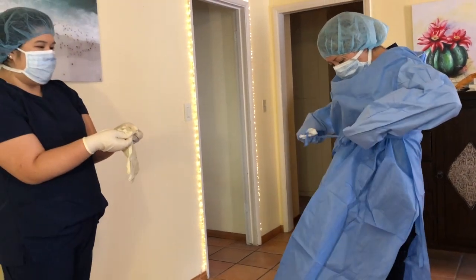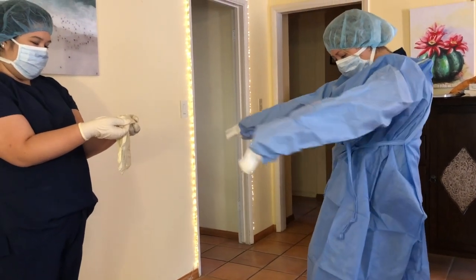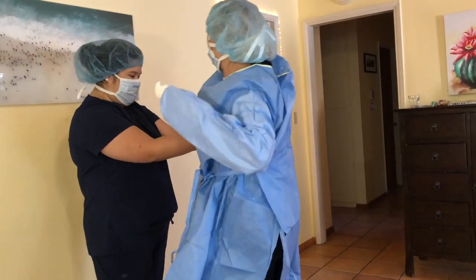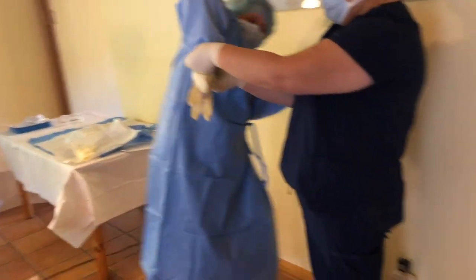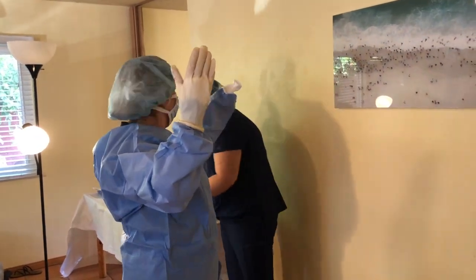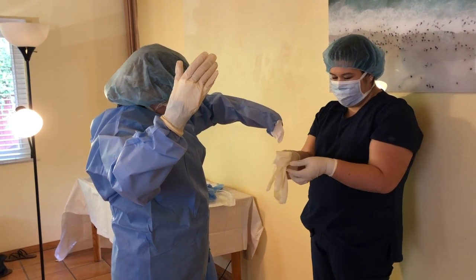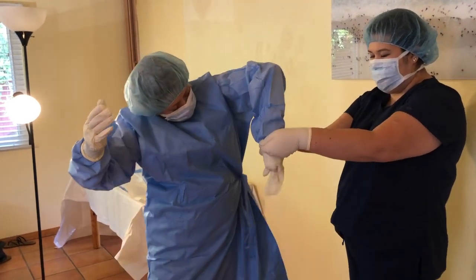After Tegan gets the gown tied, I will put her sterile gloves on. Okay. Okay. Don't let them snap.